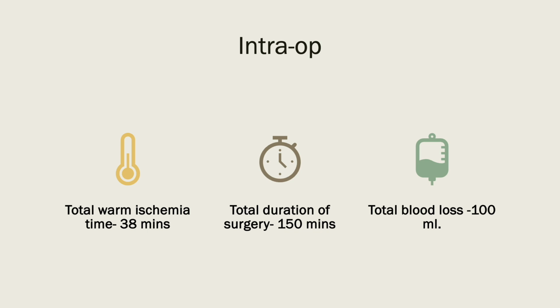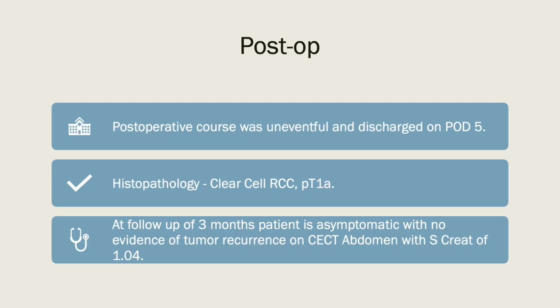Intraoperative details: total warm ischemia time was 38 minutes. Total duration of surgery was 150 minutes. Total blood loss was around 100 ml. Postoperative course was uneventful and the patient was discharged on POD 5. Histopathology revealed clear cell RCC, stage pT1a.